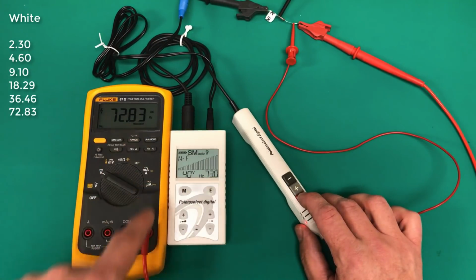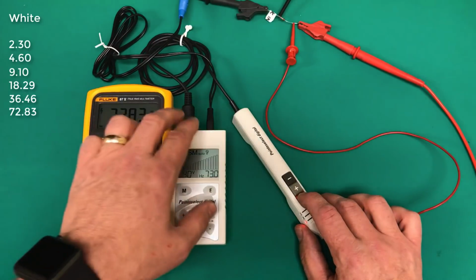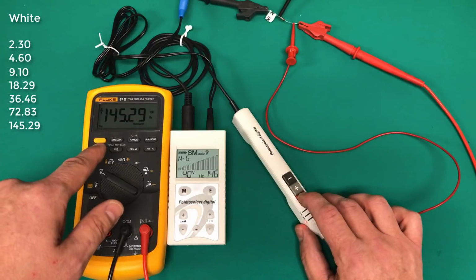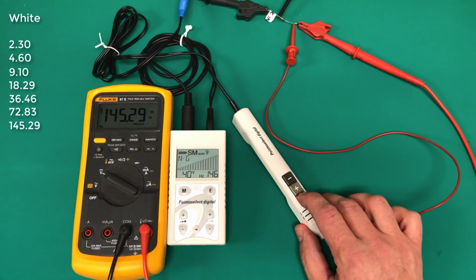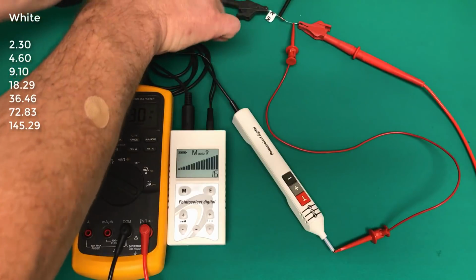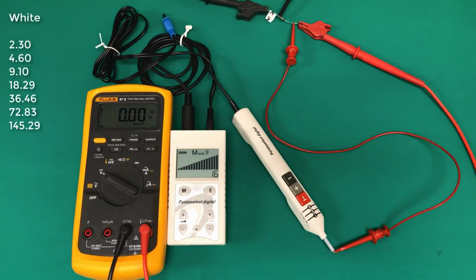73 gives us 72.83. Excellent. And 146 gives us 145.29. So you can't ask for better than that. I'm very pleased with how that's turning out. There we go, back to 2.3, 2.30. Very nice.